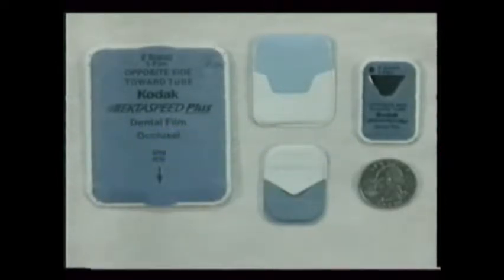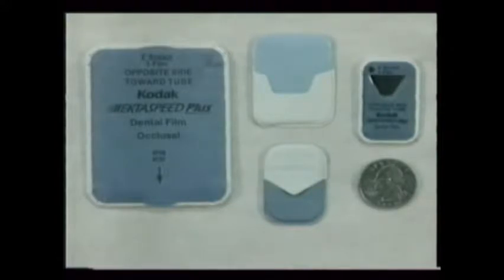There are basically two types of X-ray films made in dentistry: small films that are used intraorally, and larger extraoral films like the panoral film. Intraoral films are sized according to the need or patient demands. The smallest sizes, like the 0 and the number 1 films shown, are used in X-raying children's teeth and the smaller front teeth of adults. The size 2 film is used for X-raying the back teeth of adults and for cavity-disclosing bite wings. Size 4, the largest film used inside the mouth, captures the entire arch of adult teeth in an occlusal view. Small children's occlusal views are done with a size 2 film.